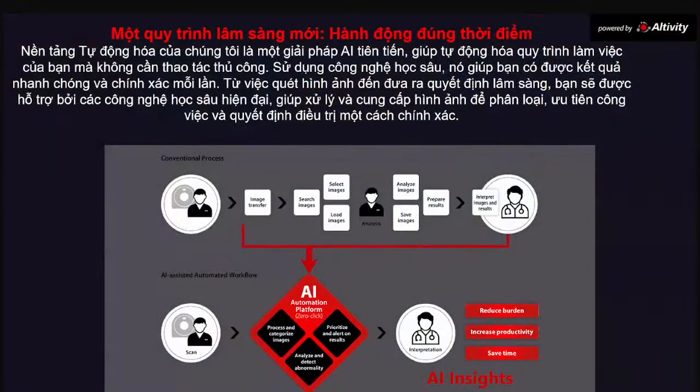On the top, you will see the conventional workflow, where we are talking about imaging in a radiology department. After scanning, whether it's CT or MR, you will have to send the images to be processed by the technicians or the radiographer before you can actually analyze them or work on neuroperfusion to prepare the result for the doctors to report. So by doing these manual steps, this will take up to 30 minutes or even 45 minutes.